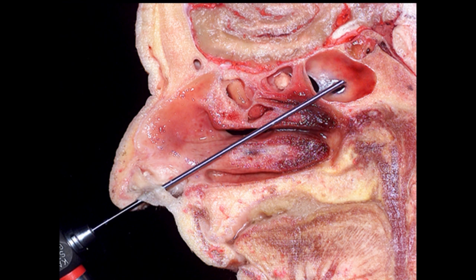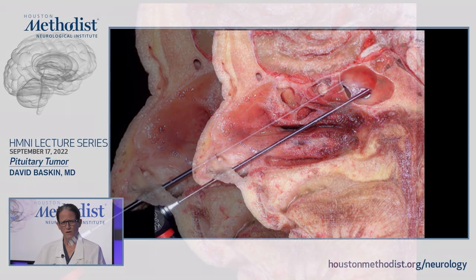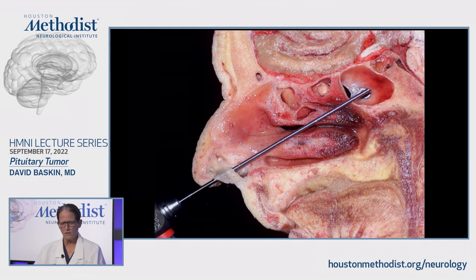Endoscopic skull base surgery is exploding. Not only can we do pituitary surgery, but we can reach all the way through the frontal sinus to the spinal cord through the nose. I'm going to limit my discussion today primarily to pituitary surgery, but many of the techniques discussed here apply to the much wider range of operations that can be performed endonasally.